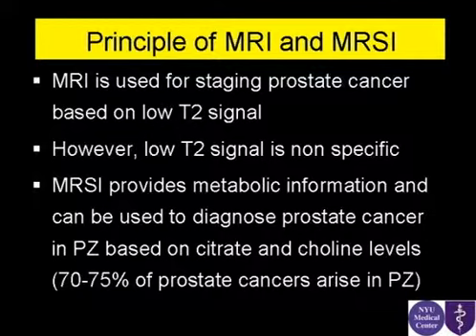So I learned to do prostate MRI at UCSF, which is a place where things were done like this. So we always get a folder with all the clinical information on the patient, and then you can give a consultation and a final impression on the patient. Okay, this is extremely important.